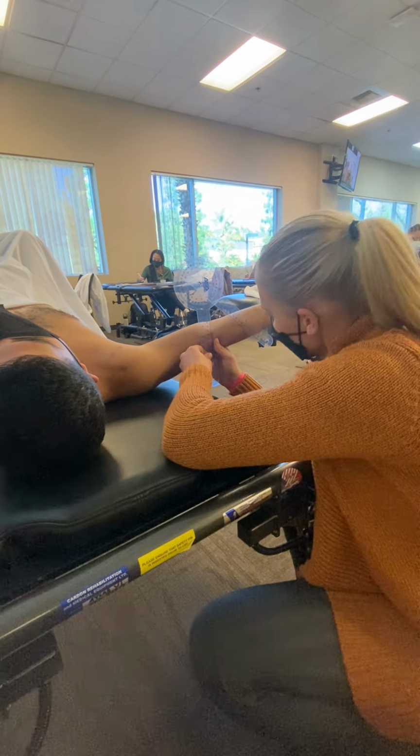Sorry, it's about 130. 135. We're not asking you to take a measurement and say he's at exactly 135 degrees, approximately 135 degrees, because what you really want to do is just imagine how those fibers are running of the sternal portion of the pec major. So you can see that they're kind of running in that direction. They're running in this approximate direction.